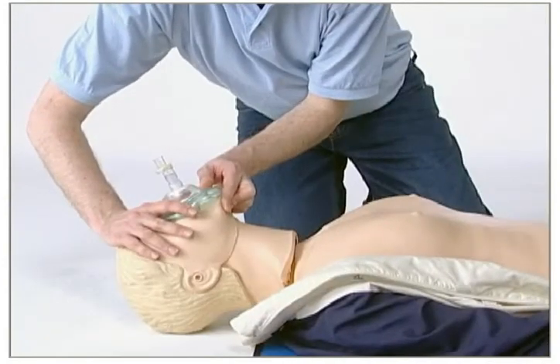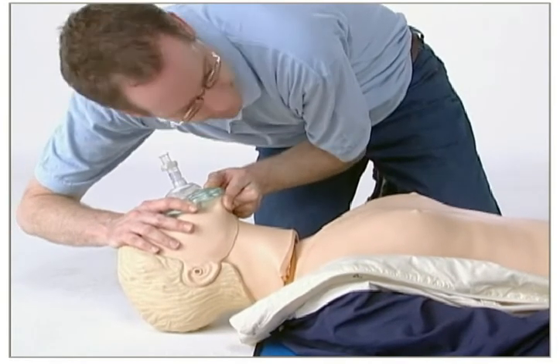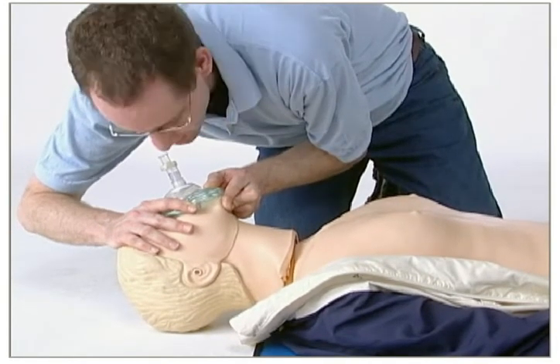If you are having trouble with the ventilations, remember to keep the airway open and ensure that you use a correct hand placement to obtain an airtight seal with the mask.